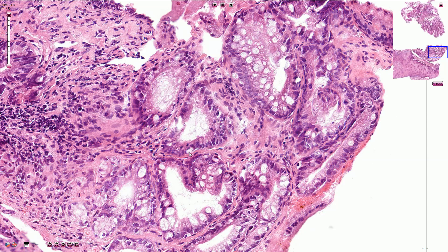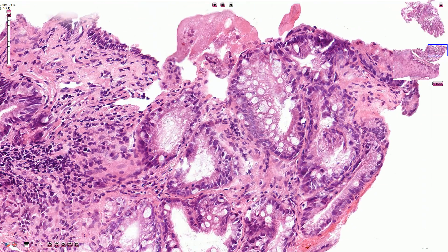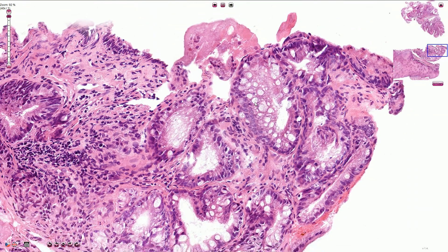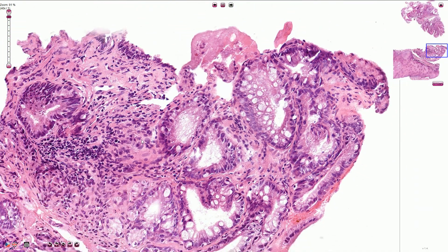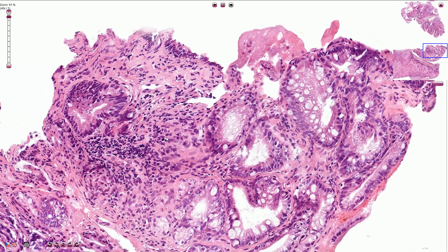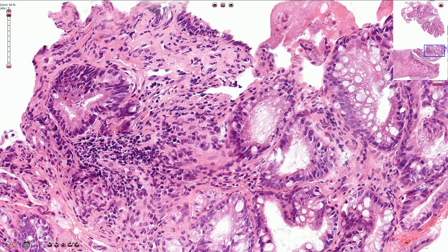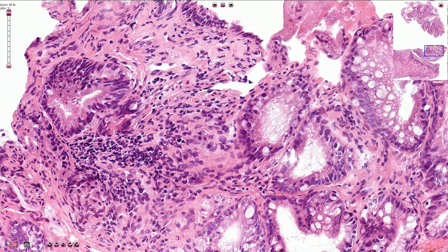Some rare mitotic figures can be present; however, nuclear hyperchromasia and distortion of the architecture should not be seen. Around the glands we can see lamina propria with some lymphocytic and neutrophilic infiltration. Here we have the lymphocytes with round nuclei, and here we have the neutrophils with multilobated nuclei.